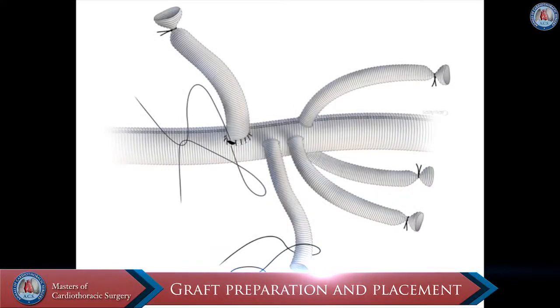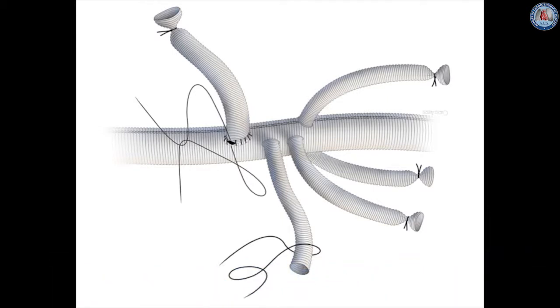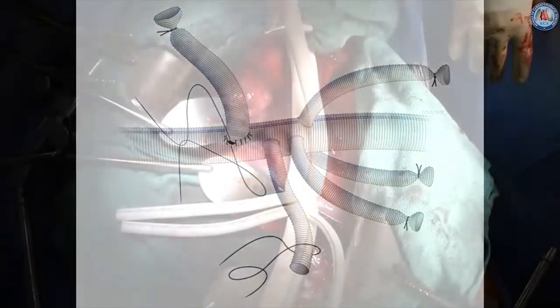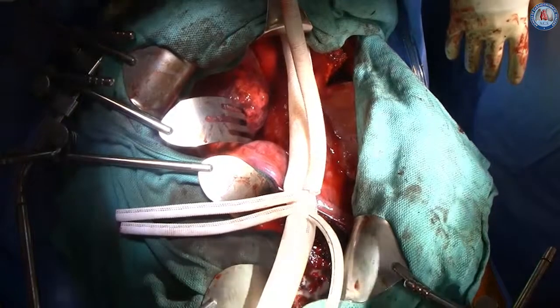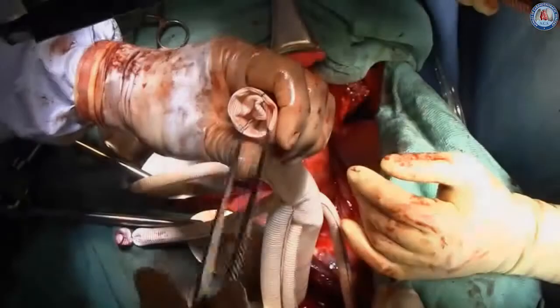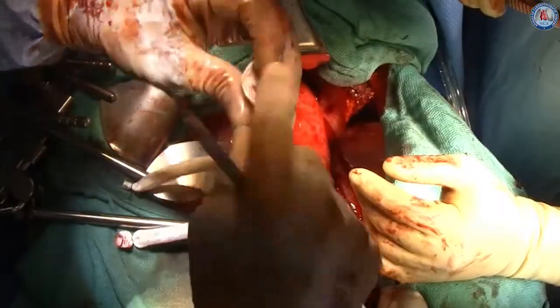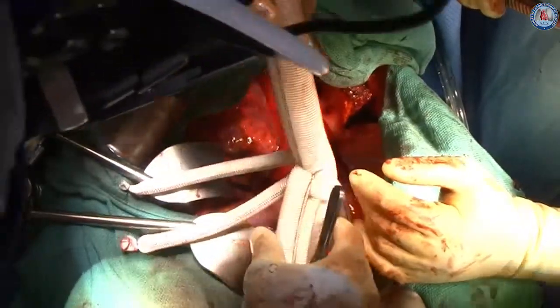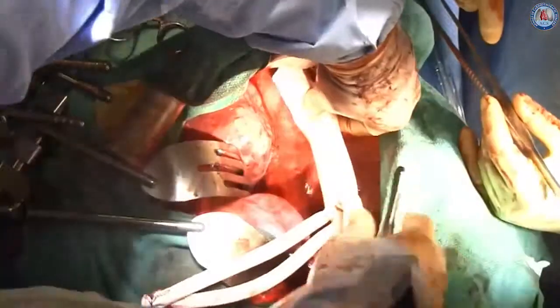An additional 14mm Dacron graft is attached to the main body, which will allow reattachment of the intercostal arteries. The graft is oriented so that the celiac graft lies at the level of the diaphragm. A reverse elephant trunk is now created in preparation for any needed procedures.